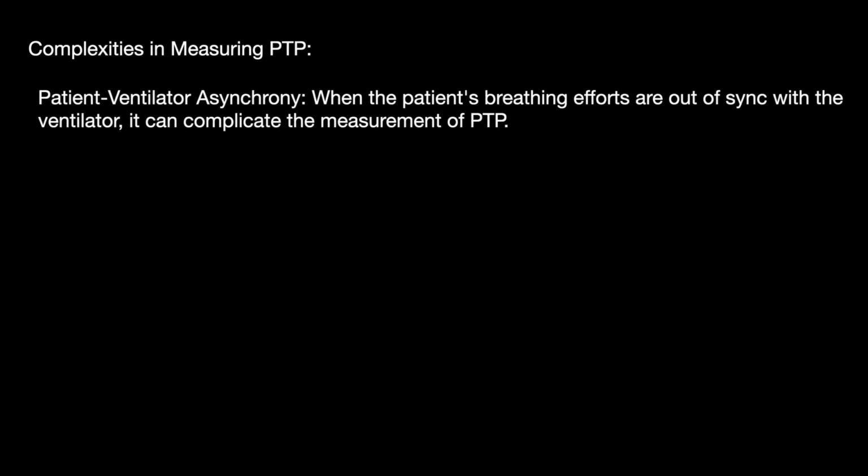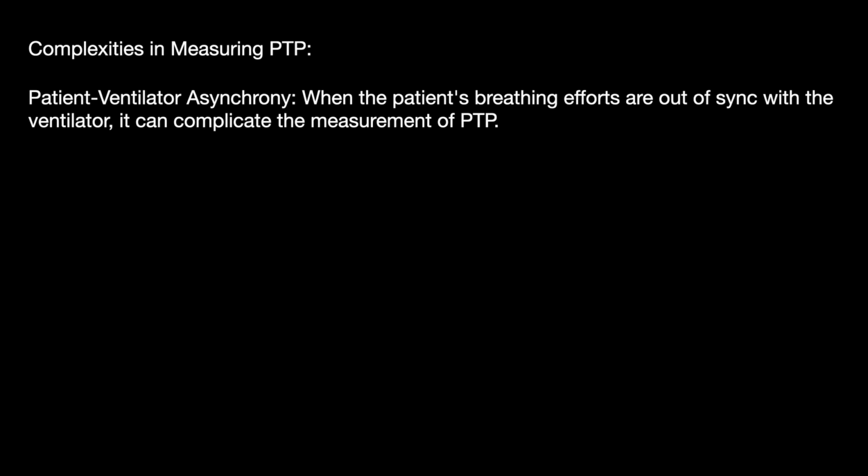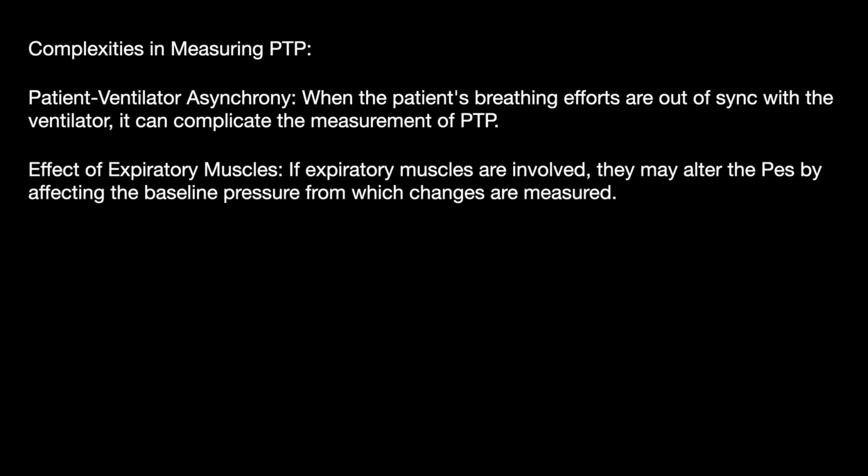So what are the complexities? When the patient's breathing efforts are out of sync with the ventilator, it complicates the measurement of the PTP. If the expiratory muscles are involved, they can alter the esophageal pressure by affecting the baseline pressure from which the changes are being measured.